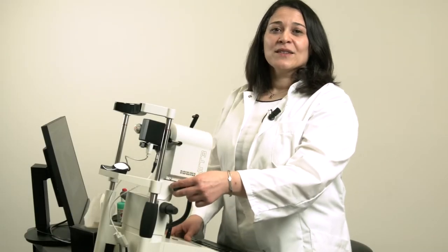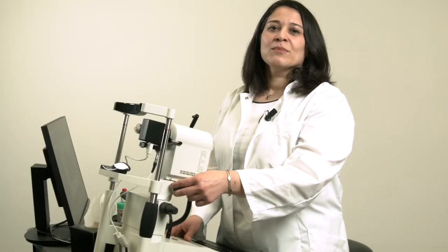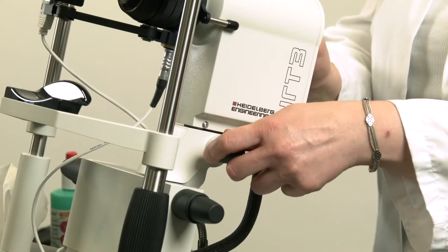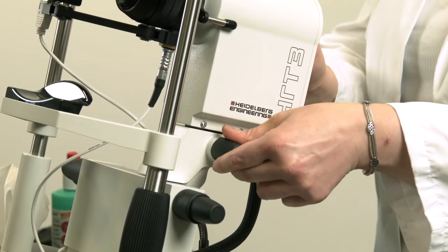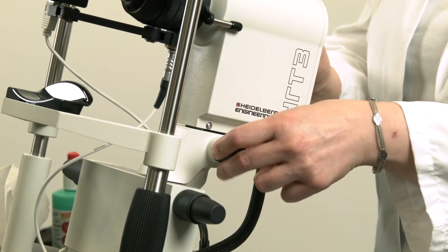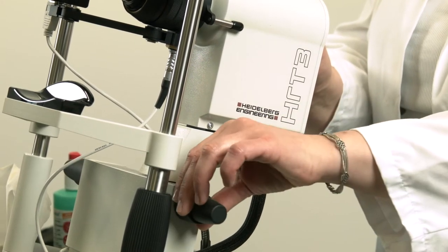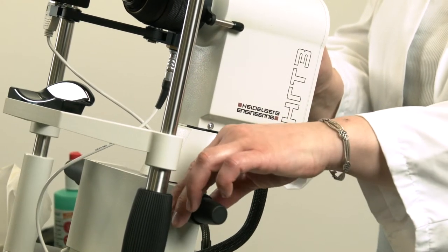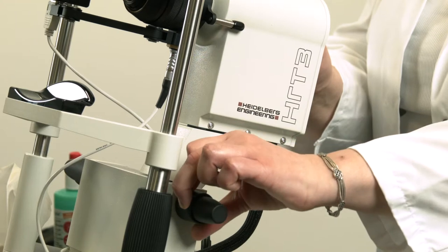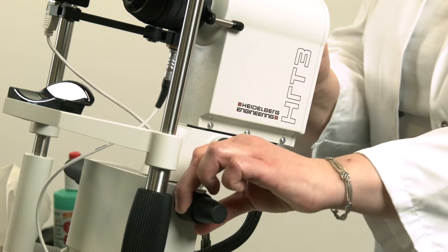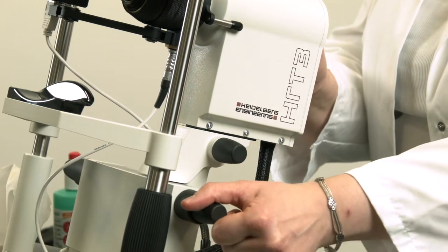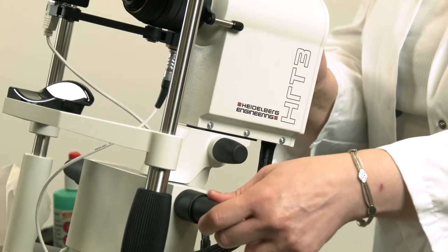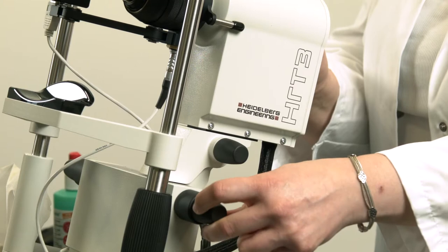The HRT3 has a total of three adjustment screws for operation. The upper screw moves the camera back and forth. The lower inner screw moves the camera up and down, and the lower outer screw moves the camera right and left.